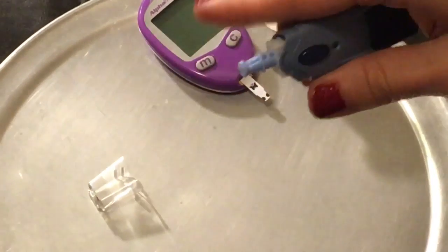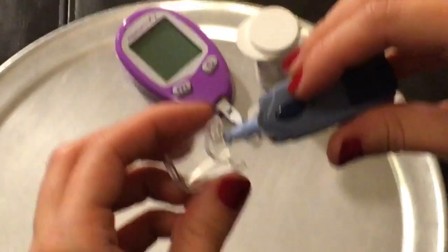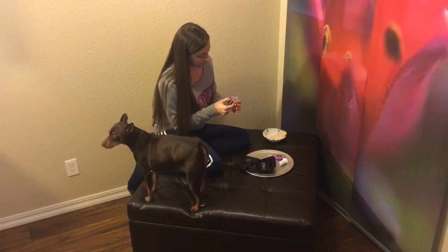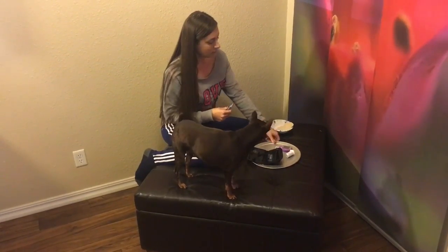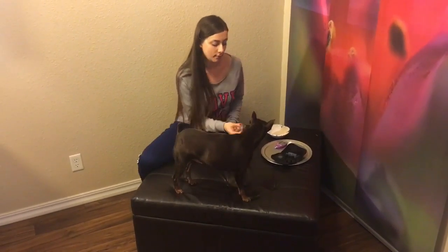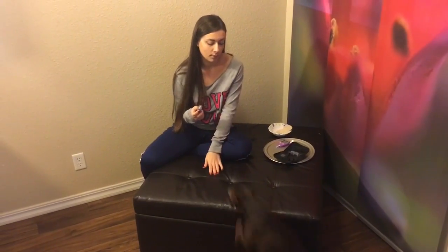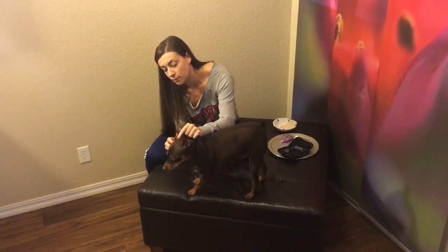We carefully take the top off the pricker without touching it, because we don't want to contaminate the sample. Then we put the clear protector piece over it. Here's the part that's hard for me, because I can see her start to get nervous — I can see her little paws start to shake, even though she's still hanging out and investigating what's going on. I've also noticed dogs are usually aware of the noises of things they're scared of, like the noise of clicking the trigger back and when it clicks in her ear.